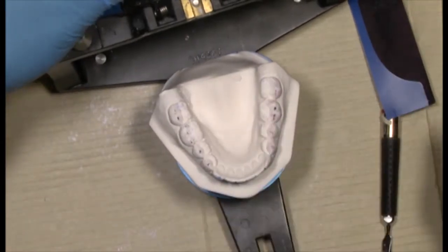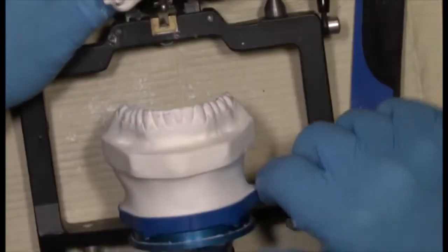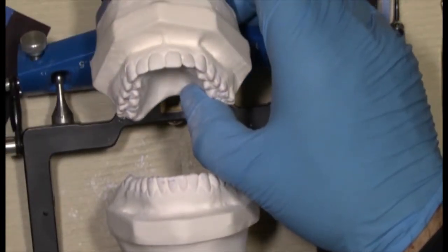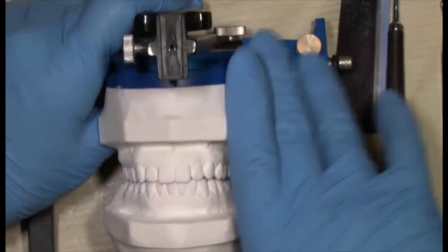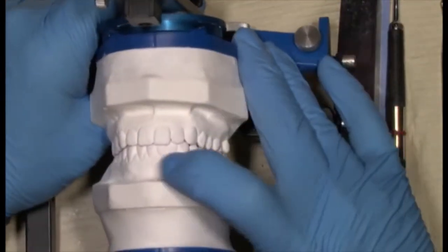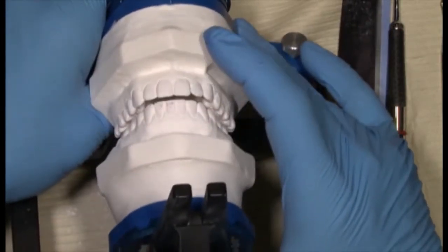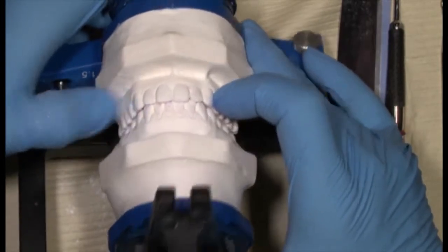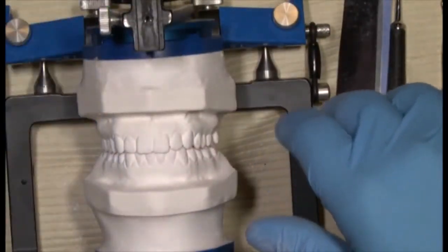In the mouth, this would be accomplished with the KS0, sometimes also with the KS4. Both of them would be fine diamonds. What we would then do is, as we get just about to the cuspid coupling, in the mouth the deprogrammer will come out, and you'll see that on the DVD. The deprogrammer will come out, and the rest of the way would be done on a brownie point. We're getting very close, as I mentioned earlier.